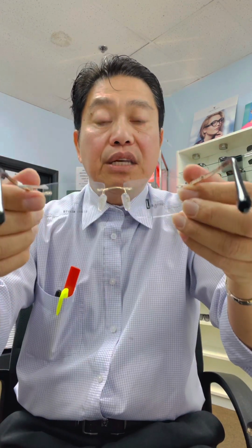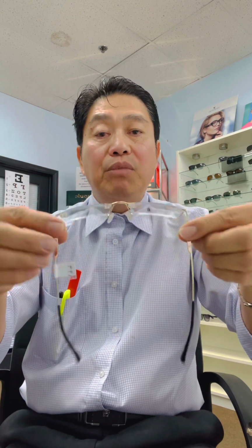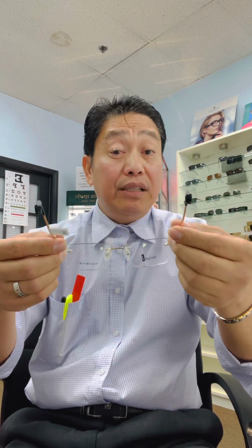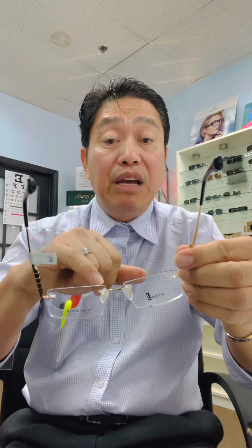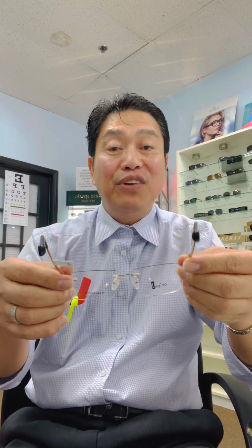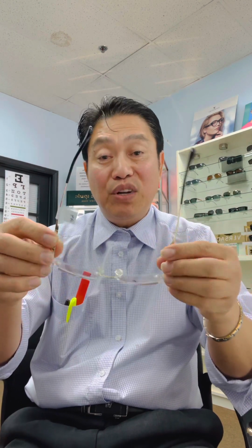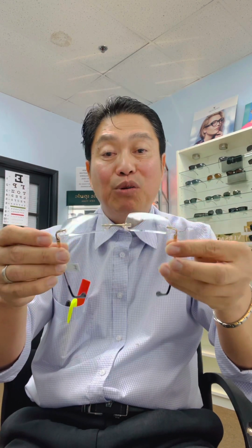They're very nice, don't get me wrong, but you have to be very gentle, because if you break them or if the plug came off, it's very high maintenance, and we cannot fix it right away, especially if you only have one glasses. With this one, you have to have a backup pair of glasses.